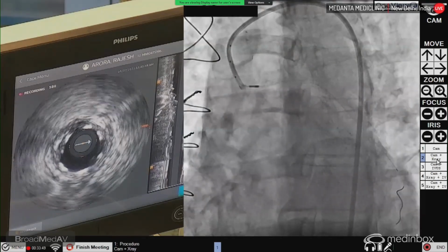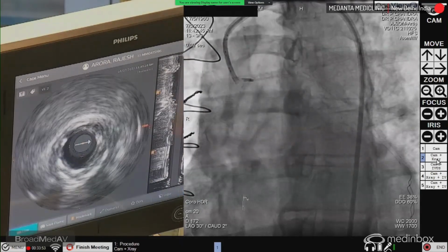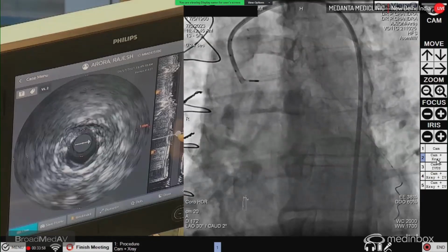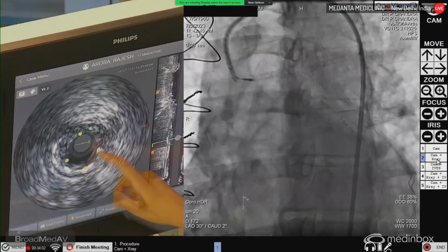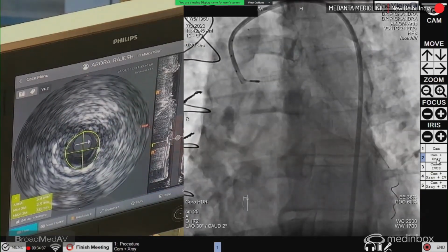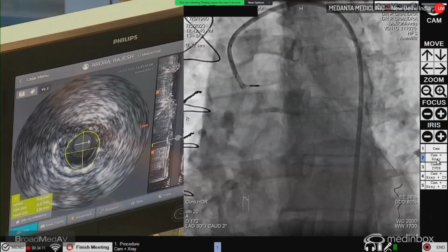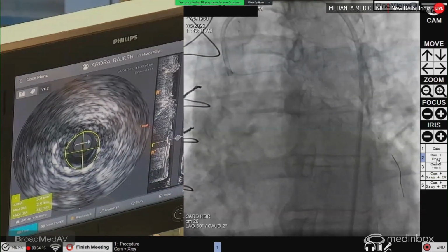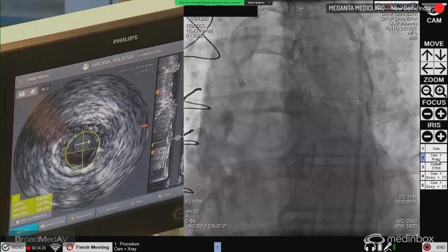Okay. So fine. Tell the MSA, please. So it is 5.4. Area is 5.4. I think it's quite good. So we don't need to really do anything about it. And I will take this out. Okay. Right. So this graft is done.